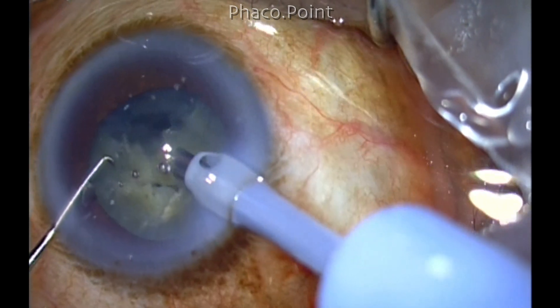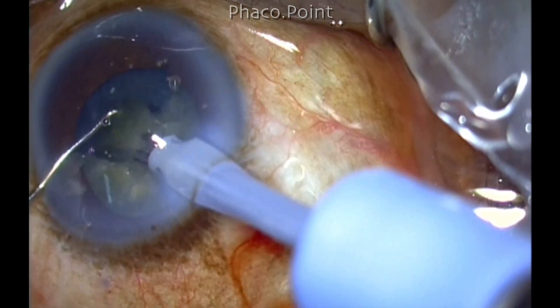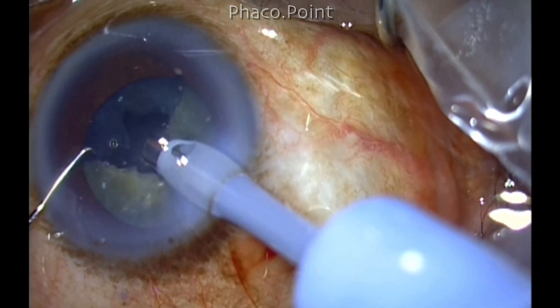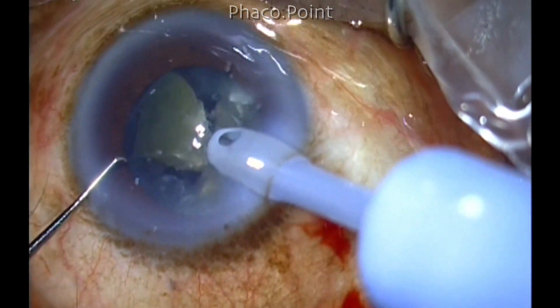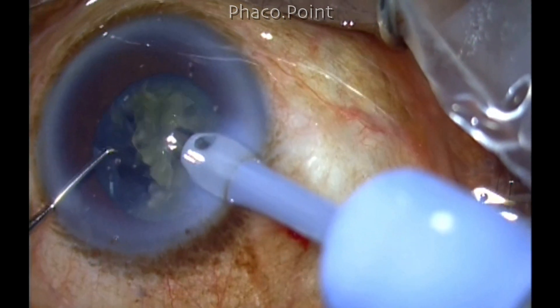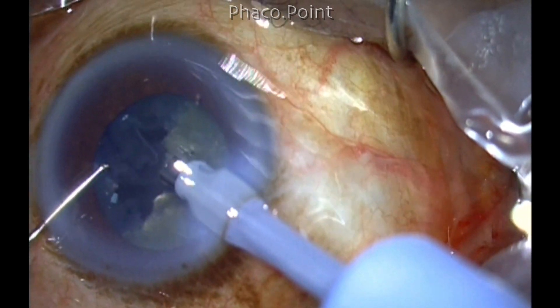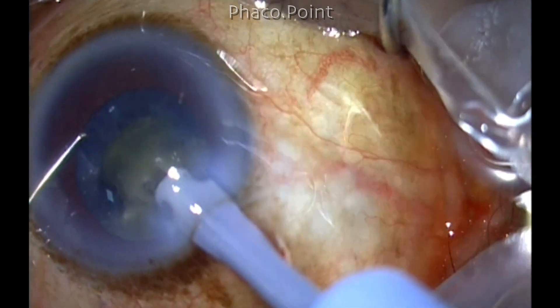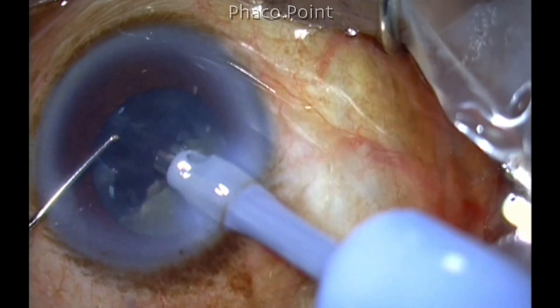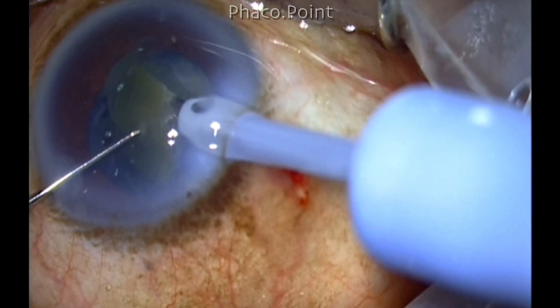I'm staying very much in the center of the eye. I use the phaco probe to attract the pieces to the tip and remove one fragment at a time. These are small fragments and they can be easily mobilized through a smaller size capsular rhexis. It's easy to impale and hold on to a nucleus fragment by directing the bevel of the phaco probe towards the fragment — just by turning the bevel towards the piece, the vacuum will cause the piece to rise up and hold on. Make sure that the fragment separation is complete and the fragments are individually separated, otherwise you will not be able to mobilize. Of course, you can also rotate it downwards and pick it up from the six o'clock position.